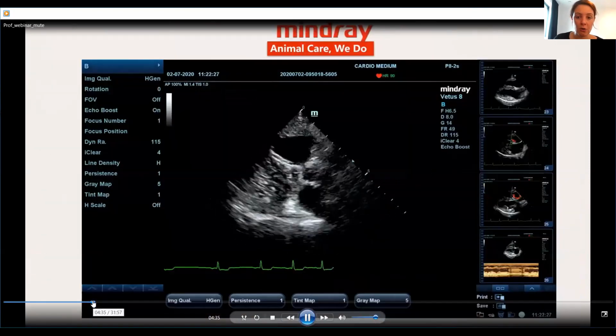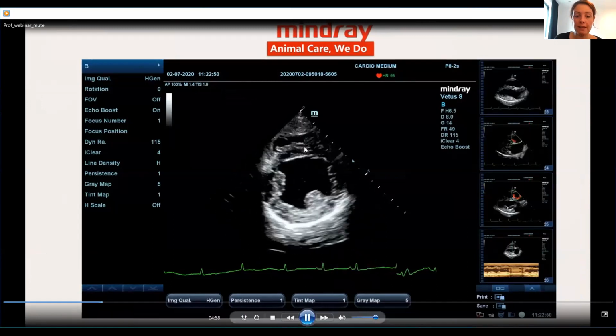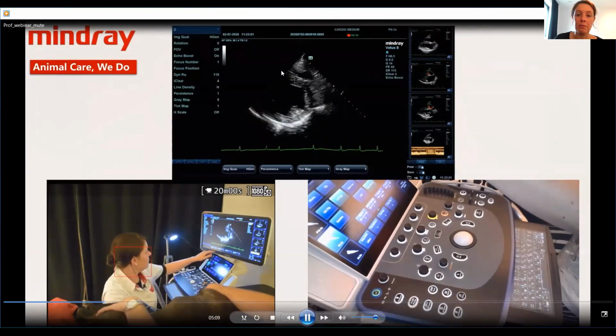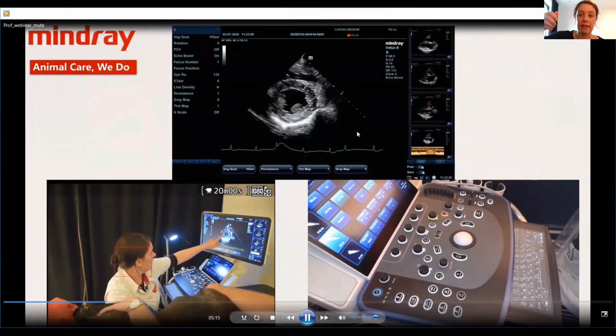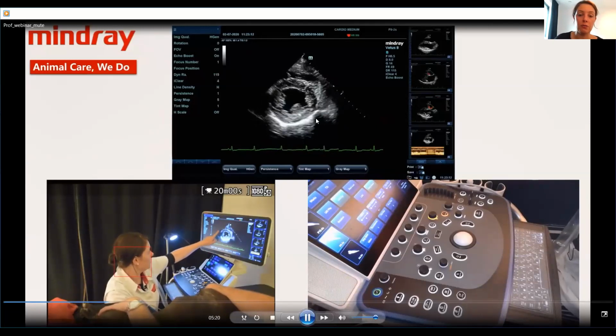So then we go on to our short axis view at the level of the papillary muscles. So you see again, she's moving and breathing. So here are the papillary muscles here and here, the lumen of the left ventricle, and then here above we see the right ventricle. And every now and then I tilt my probe a little bit like this, and you can see actually the mitral valve coming into view.